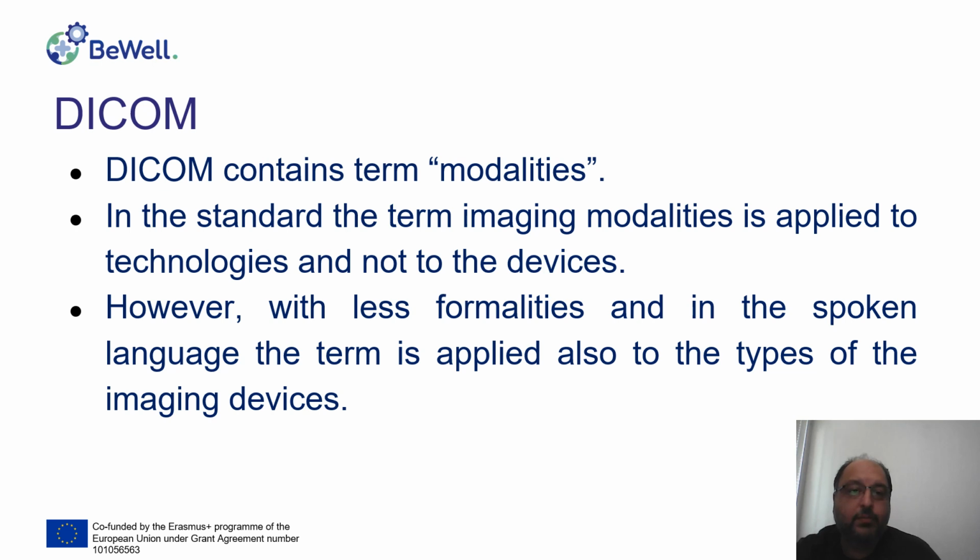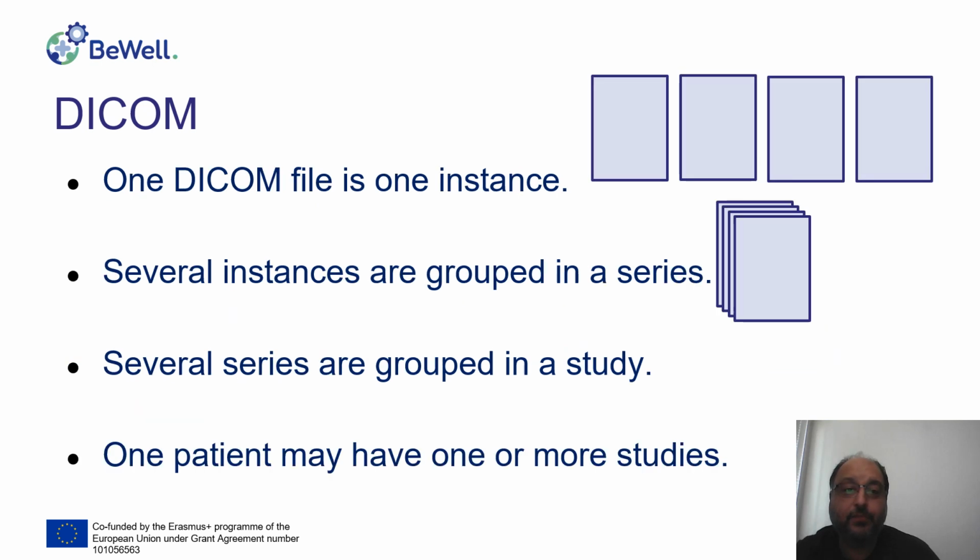The DICOM contains terms, modalities, in the spoken language. Very often the devices are called modalities, and this is widespread practice, but technically speaking, the modalities are the technologies.